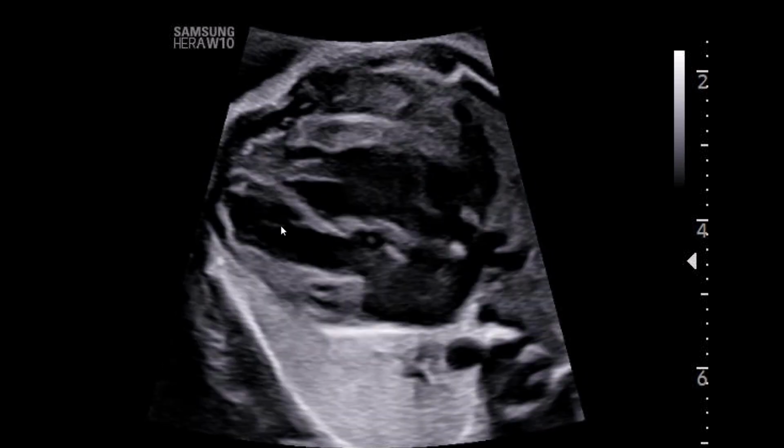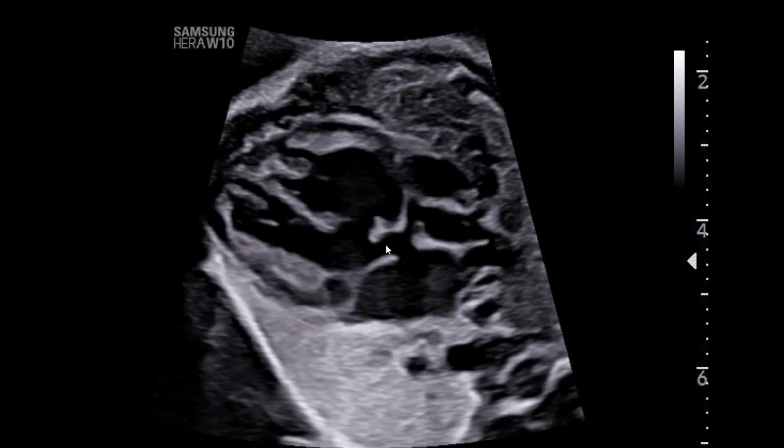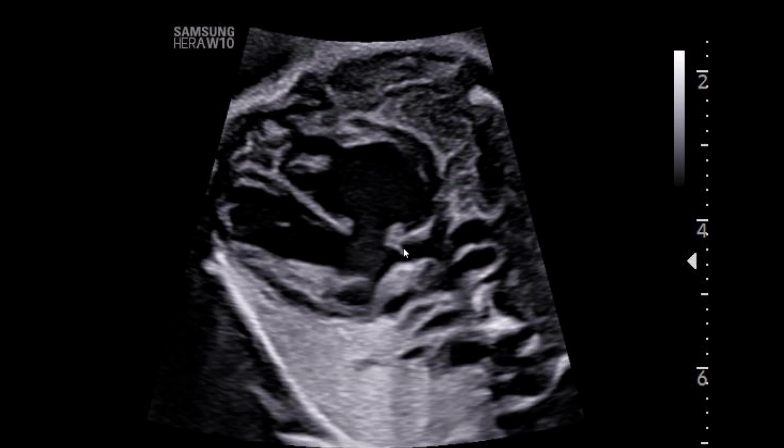That connects normally to the left ventricle, so that's a concordant connection. And then that left ventricle gives rise to the aorta via this left ventricular outflow tract, and that connects concordantly to the LVOT, the aorta, and that aorta is coursing rightward.